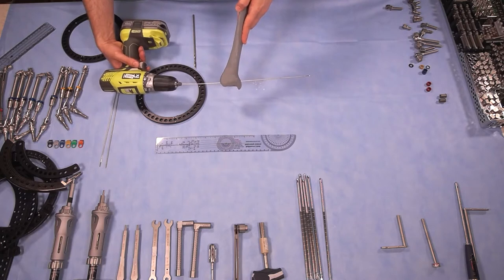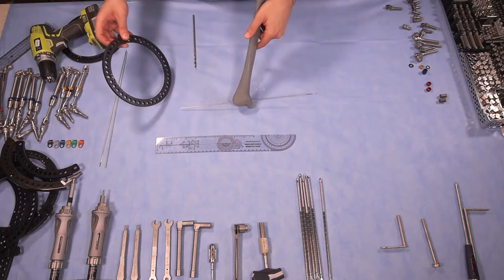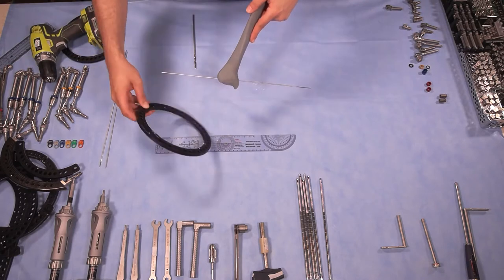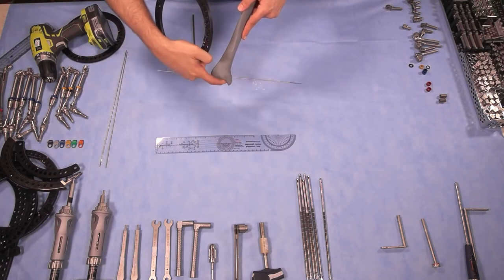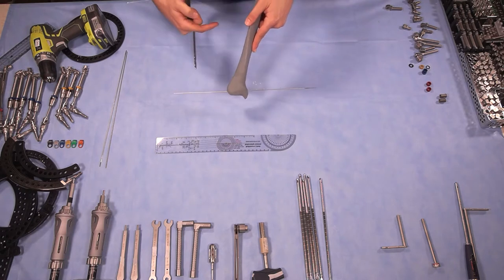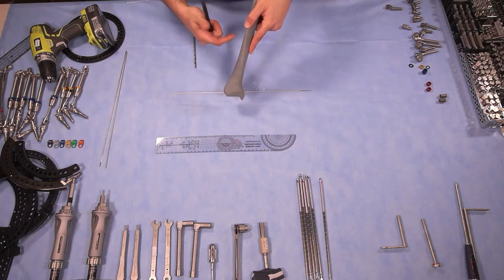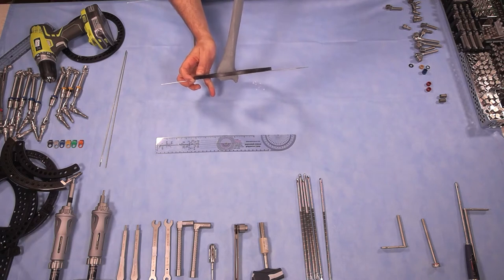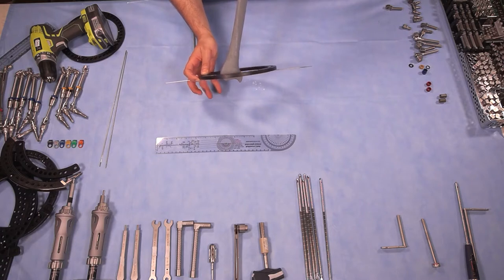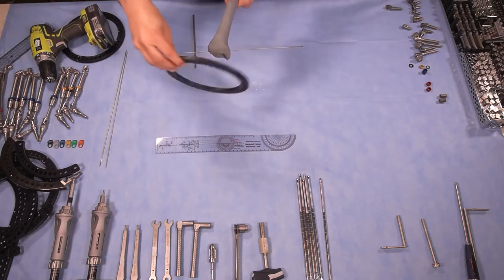The wire is close enough to parallel to the joint, so we're going to accept it. Now you have two choices: you could put the ring at the bottom if you do not need to see the joint, so as not to obscure the area of deformity correction. However, if you need to see the joint and don't need to see what's happening above, you could put the ring above, which allows you to view the joint well during follow-up. Here, because we're correcting a distal metaphysis deformity, we are going to put the ring at the bottom.